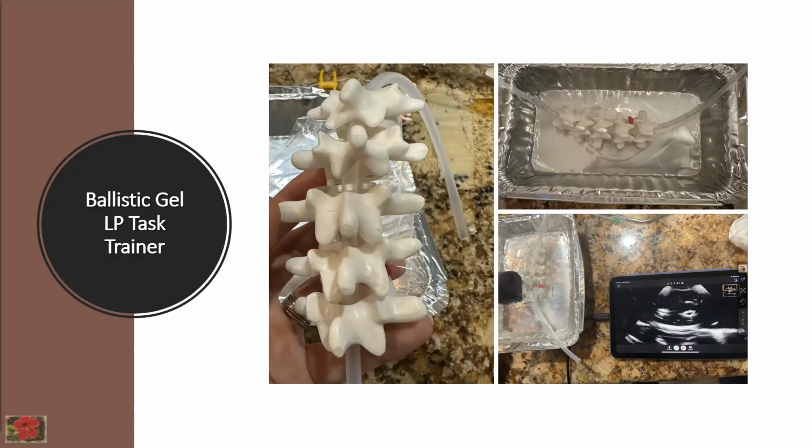Yeah, now I'm going to talk about it with the UVC, UAC. I don't have a slide for the vascular access trainer because it's pretty similar to the UAC and UVC trainer. I use metal straws, and I've actually had luck with it because it can sustain the temperature for a long time in the oven. But also if I make just a clear test trainer or mold in the oven using the foil, I can leave it in the oven for hours. And then when I'm ready, I'll just make a hole in the foil itself and place the metal straws on different levels. So I make a shallow vessel and a deeper vessel, as many as I want.